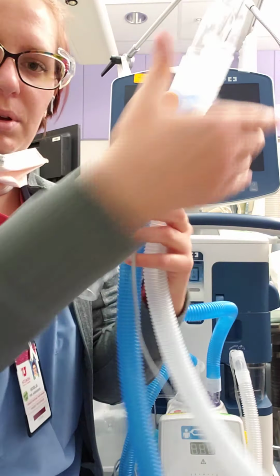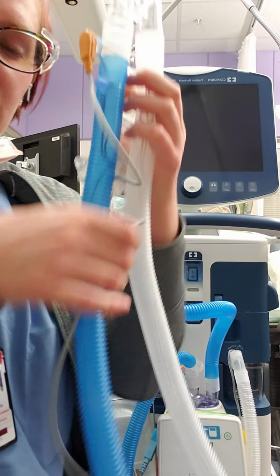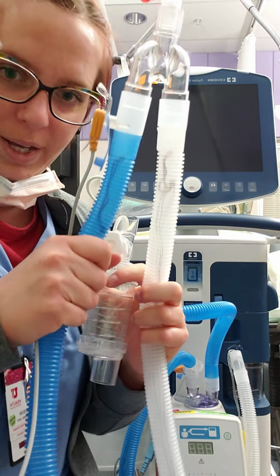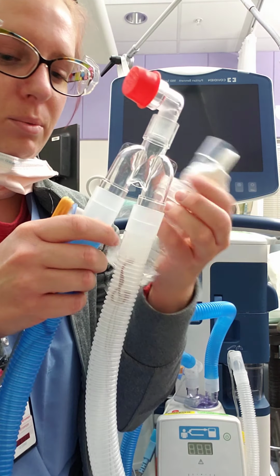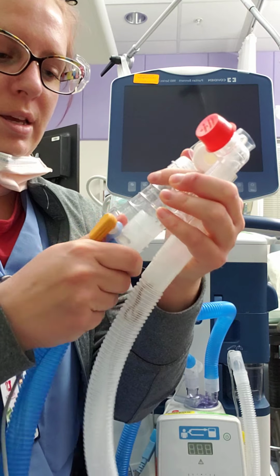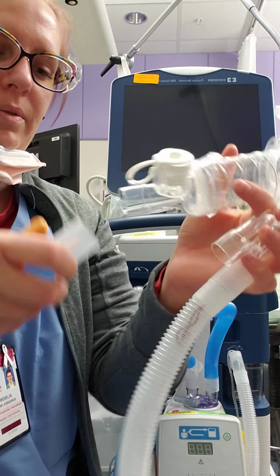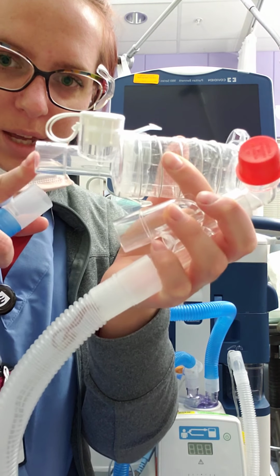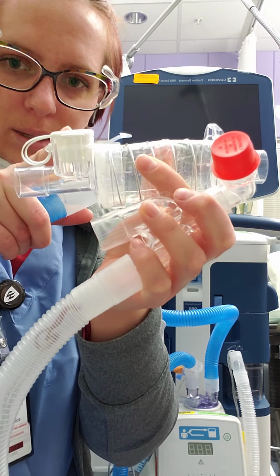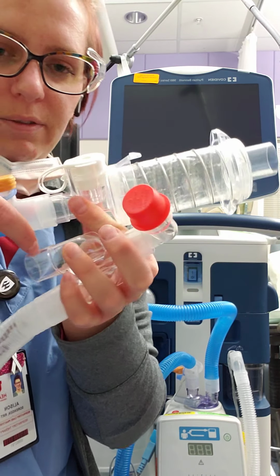So on the circuit where you would place this, remember, blue is inhalation, white is exhalation, and this is the Y. We would take the spacer, this, remember how we said this is the end closest to where the MDI will be actuated, further from the patient.